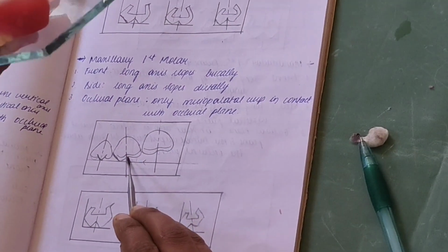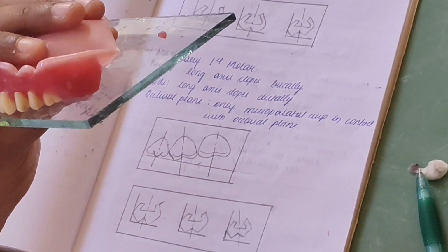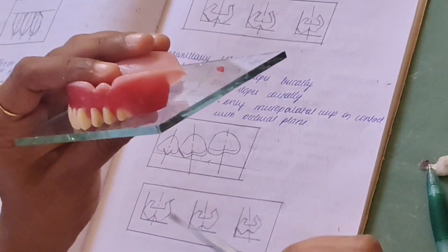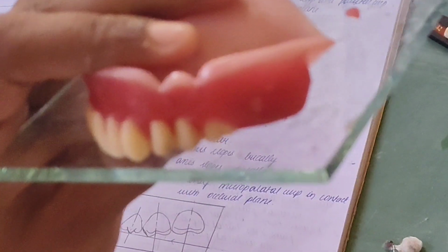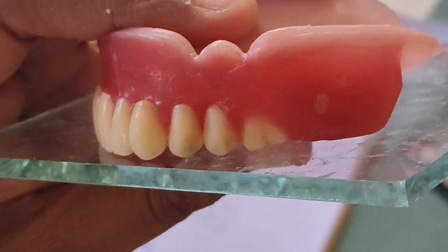The palatal cusp we can see, 0.5 mm more prominent than the buccal. Buccal will be a little ahead. Apart from that, the mesiopalatal cusp will be touching the glass plate, and both the distal cusps won't be touching. Like you see, distal cusps are more prominent.